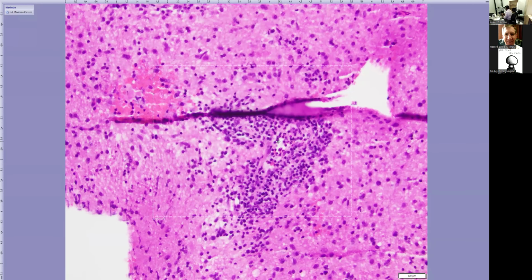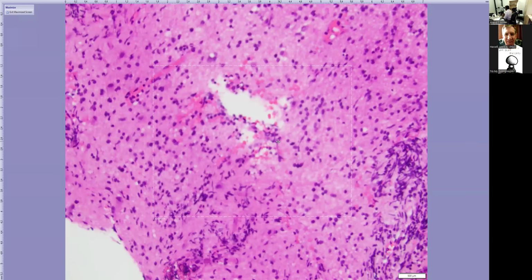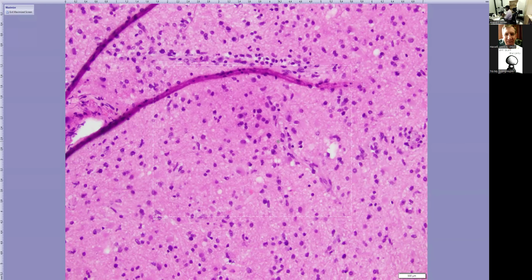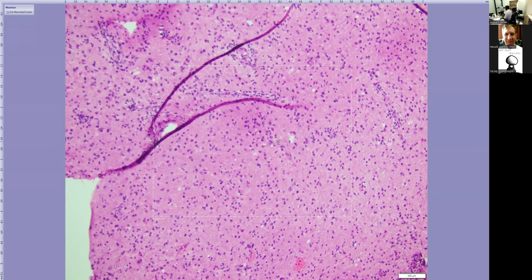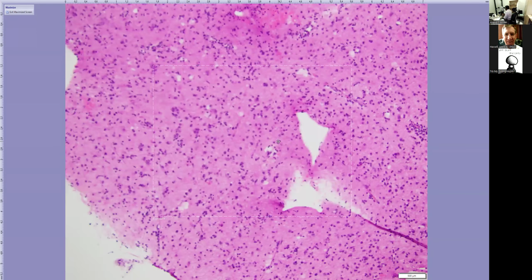So there's this perivascular small lymphocytes and some neutrophils in the blood vessel. And then when you come across the brain parenchyma itself, this looks more busy than the previous brain parenchyma. You still have some areas where there are those glial cells, which are prominent, but this time it looks like infiltrating small to intermediate size cells. The differential at this point was pretty wide.